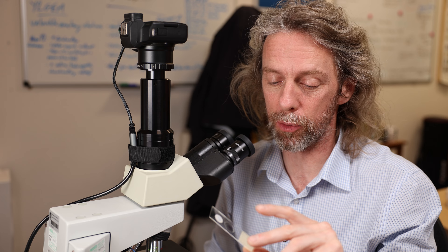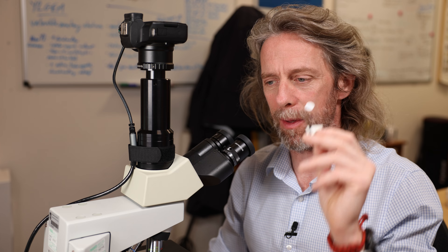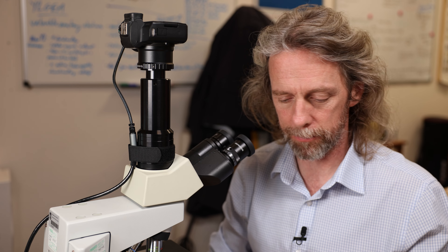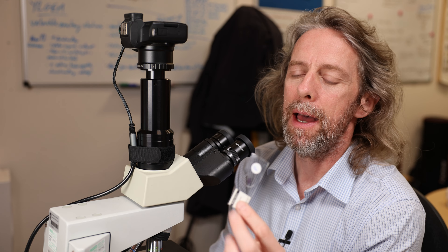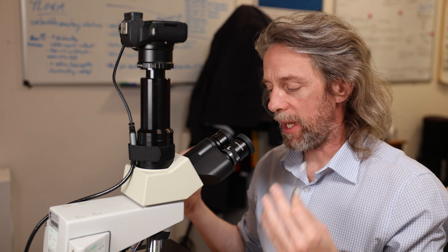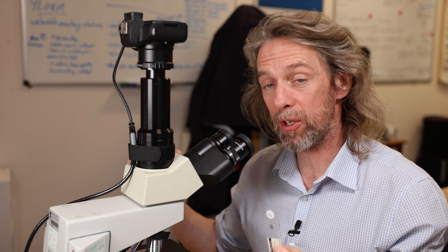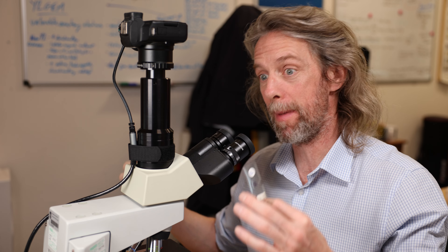We are going to look at the histology of the spinal cord. I was thinking about doing the whole central nervous system, but when you can talk for half an hour about the blood vessels alone, that's not a good idea. So we'll look at the spinal cord today and then we'll do cerebrum and cerebellum in the future. This is going to be a gentle look at the spinal cord.